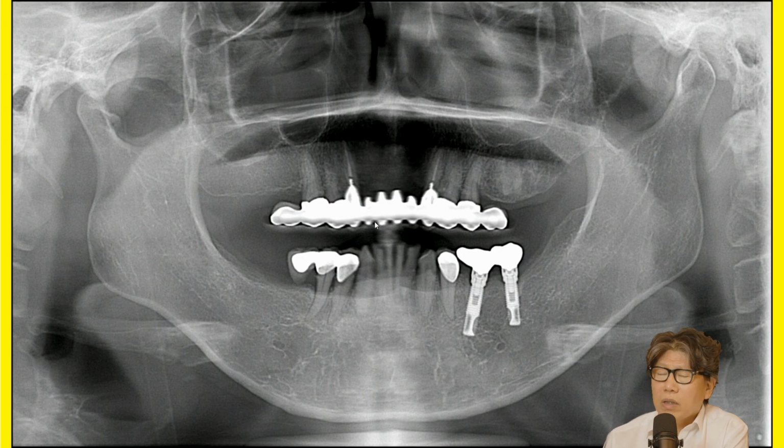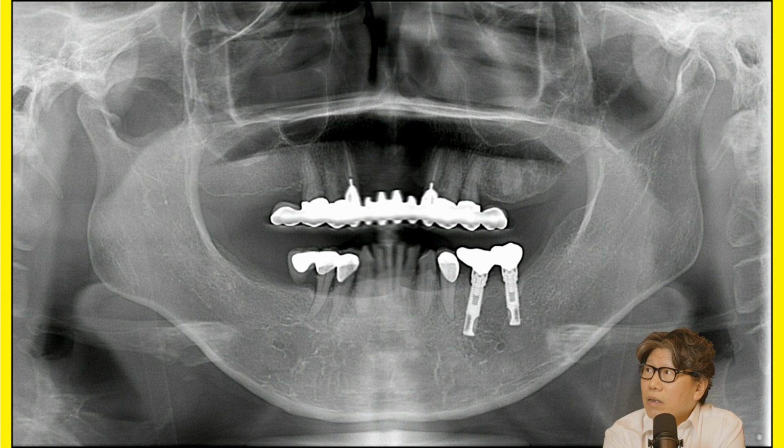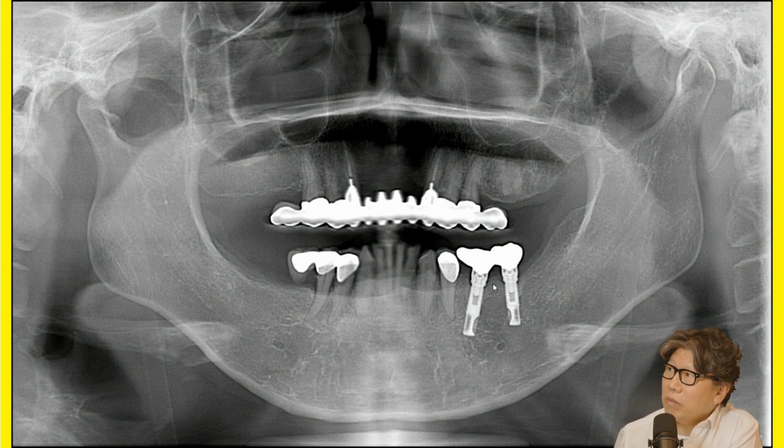And I heard a lecture once upon a time. I think there was a professor named Ramfjord. I took a periodontal lecture, and he's a prosthodontist at the same university, and he said he did this, so I did it. And it lasted 30 years. I think it lasted 29 years. I had quite a few cases where I did this. But at that time, implants were very expensive, so I did this, and I was a rookie, and I planted it wrong. This is what I pickaxed.